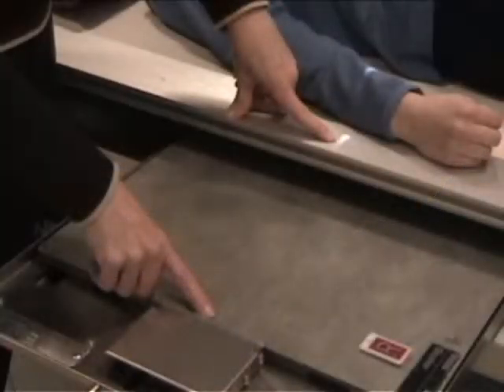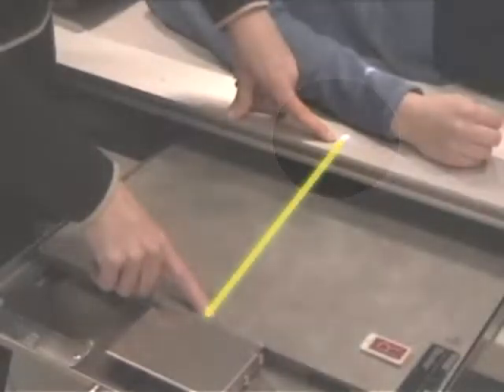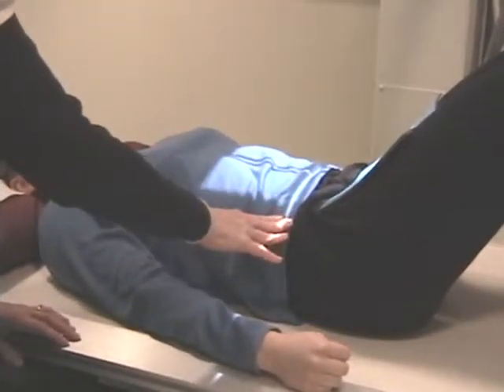If you can look down here, here's a centering gauge. I think you can see it on the table. It should line up with the center of the film. Floating tabletop, it's a good practice to line those two up. And then you can just push the bucky tray all the way in, and then we focus on the patient. The tube and the film will be lined up. Now we just have to center the patient.